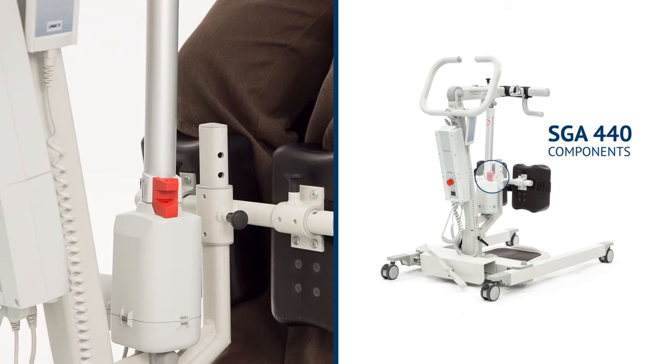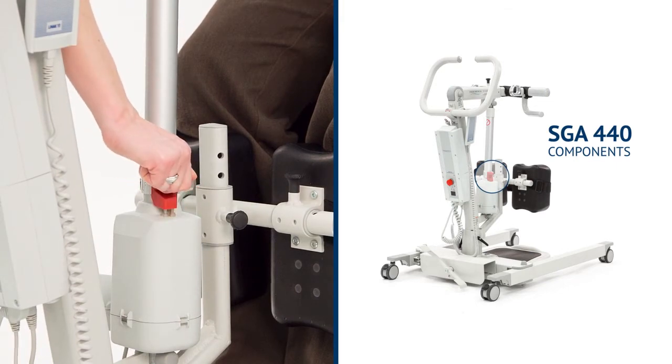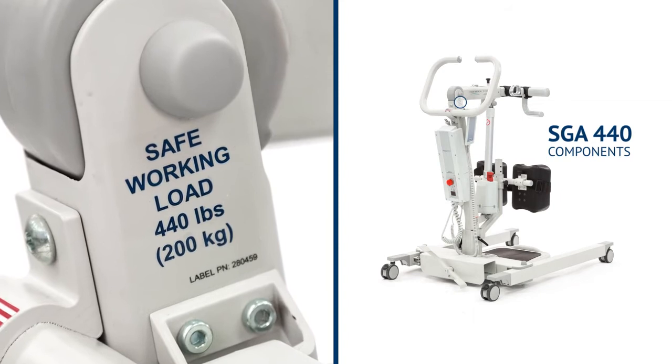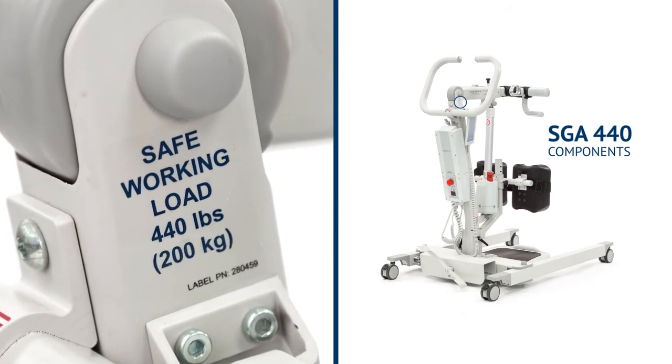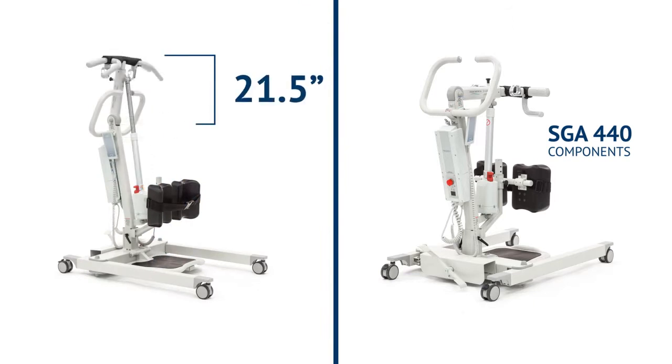The SGA 440 can be lowered in an emergency by lifting the red tab on the actuator piston; this will only activate when there is a load on the boom. The safe working load, as seen on the label on the mast, is 440 pounds. The lift range is 21.5 inches.